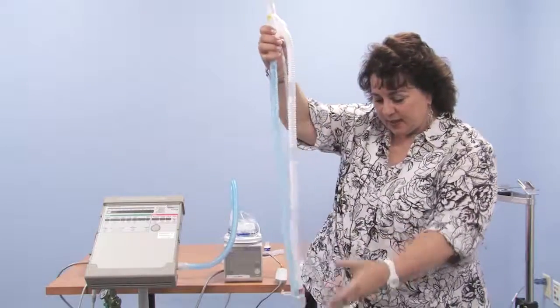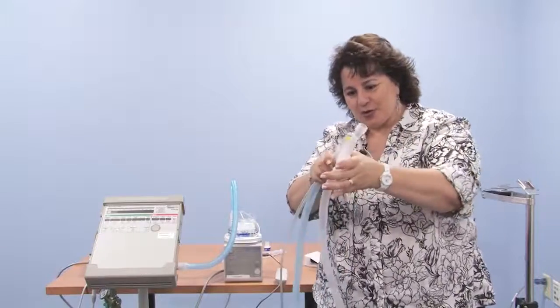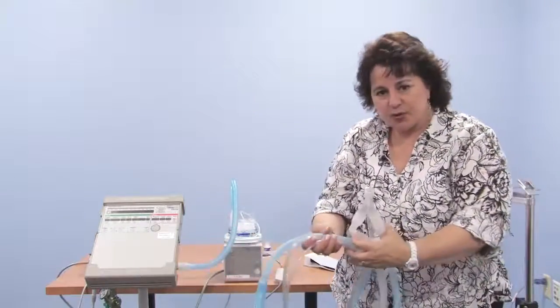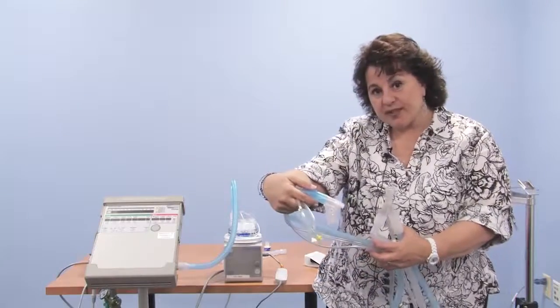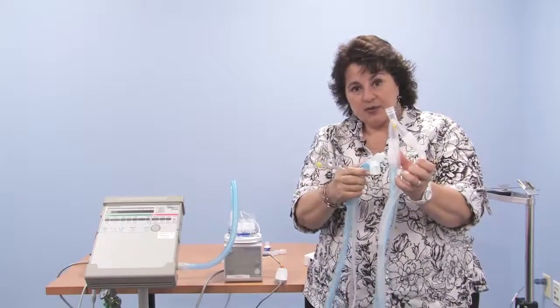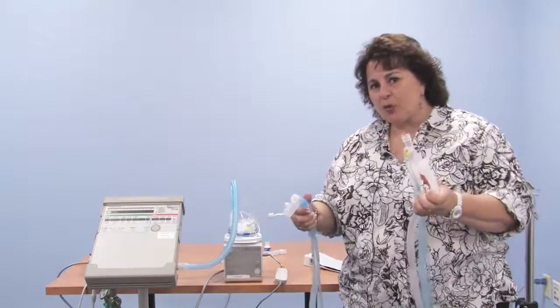This is the other piece that comes in the circuit. It may look a little crazy, but you'll get used to it and you'll be very comfortable with it after a short while. So the longer hose is the inspiratory hose. It has the wire in it. It has a connector for the wire for the humidifier. It has a connector for a temperature probe, both at the outlet of the humidifier and up near the child's tracheostomy tube. That's what helps the humidifier know what the temperature is and what to do with the heat and what to do with the wires.